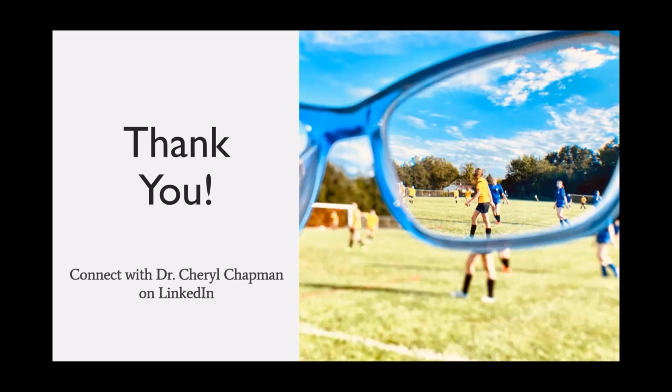Okay, we have another question here. You mentioned the false central island caused by SPK. Do you have to discontinue wear temporarily to treat this? That's a wonderful question. I would say no. You just need to figure out what's going on to cause it.